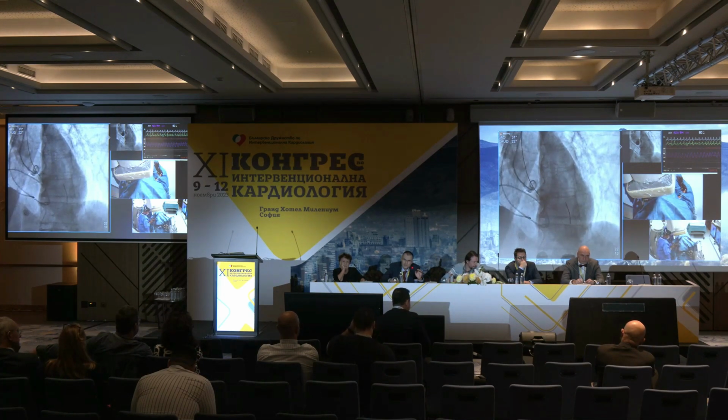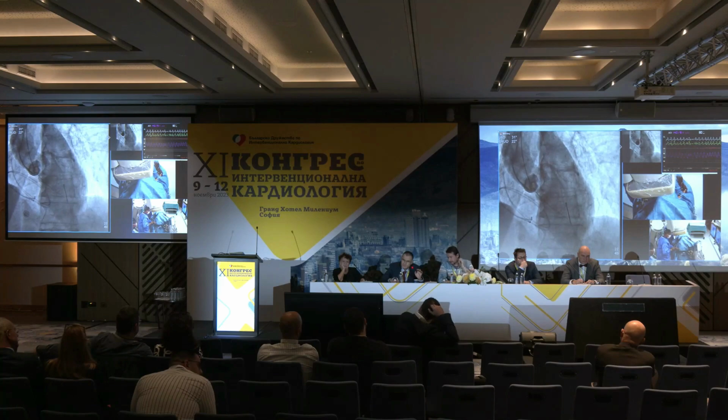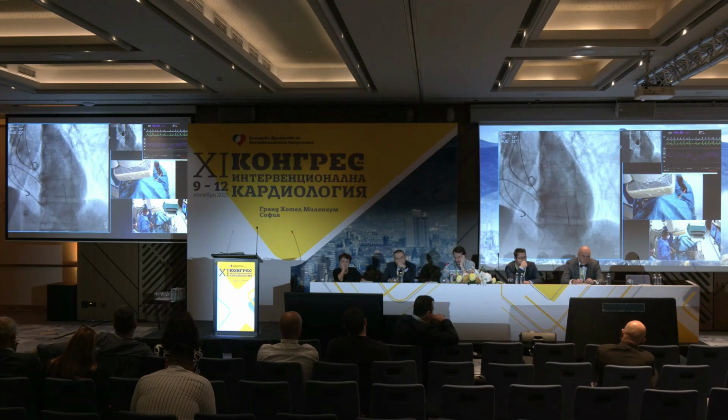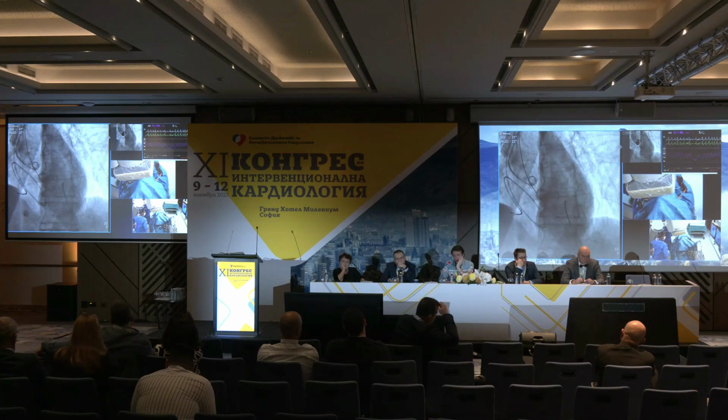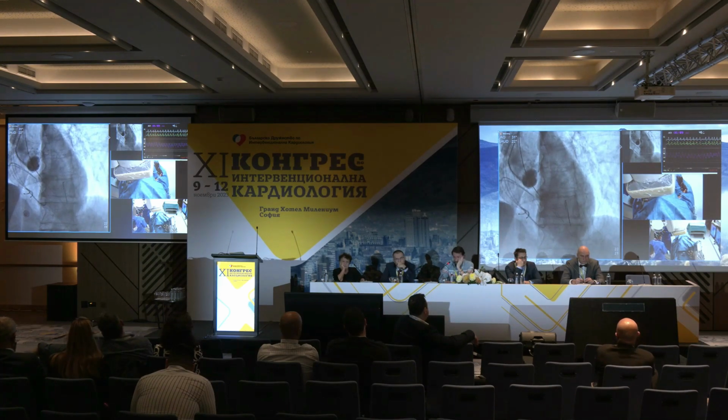Is the patient under general anesthesia? No, not at all. She's under conscious sedation. She's doing very well, excellent pressure, 100% saturation, no problem at that moment. And she's absolutely calm without any complaints.